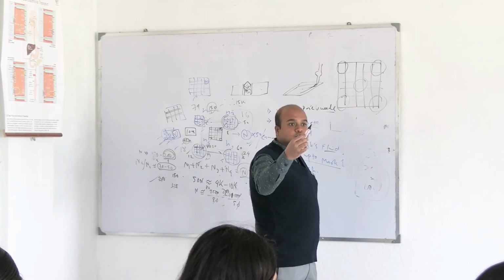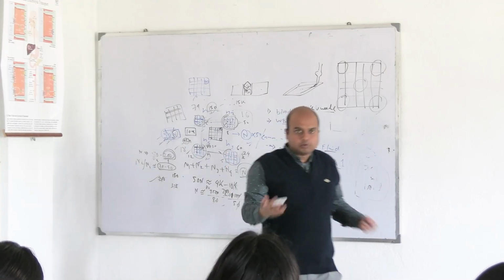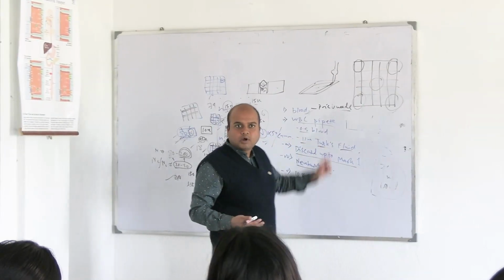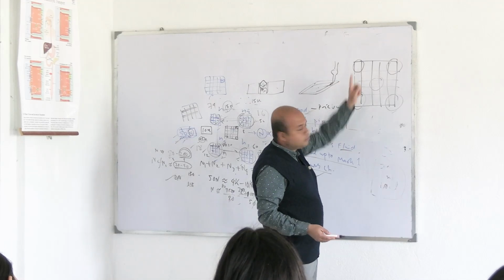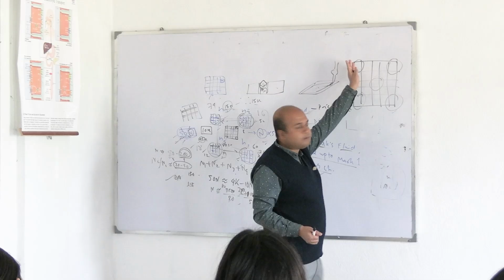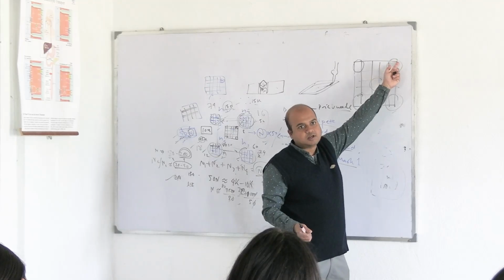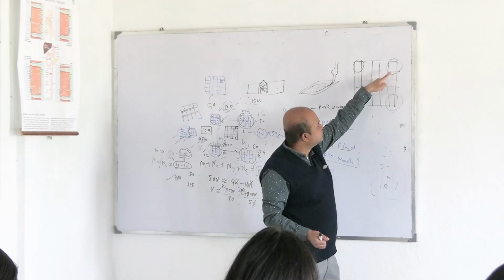In case of WBC squares, at the left upper, left and upper there is nothing, not the chamber itself, and on the other sides there are triple lines. In the RBC case, left and upper are triple lines and the right and lower are identical RBC squares. Conventionally we start with the left upper, you can start with any of these, but if you start with the left upper, you move 3 and reach this and confirm this by the presence of triple lines on the particular sides. In case of right upper, the right and upper sides will be triple lines, other sides RBC squares.